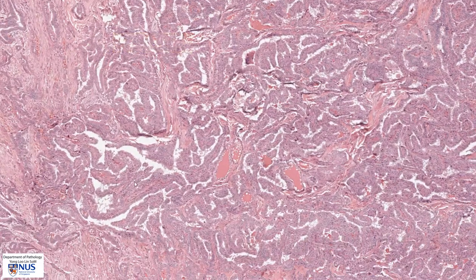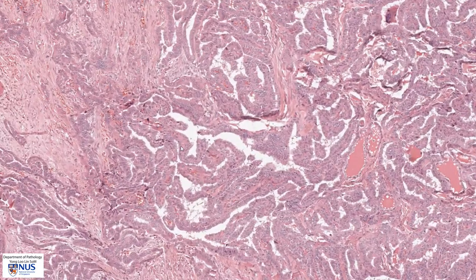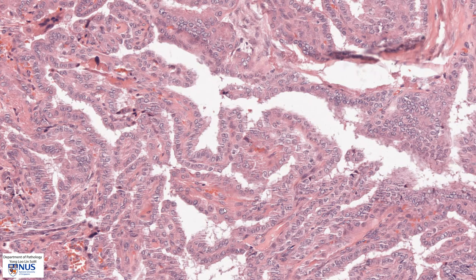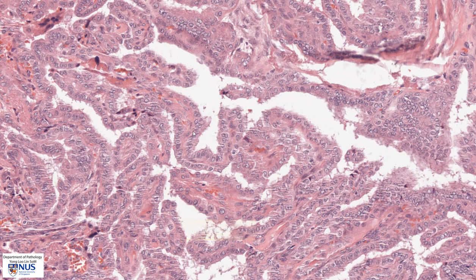Zooming in on these, we can see that these are finger-like structures. We can see that within these papillary structures, right at the core, there is a small blood vessel. So these are fibrovascular cores of papillary structures. Here is another papillary structure with a very slender vessel running within the core. And these papillary structures are lined by neoplastic or malignant follicular cells.